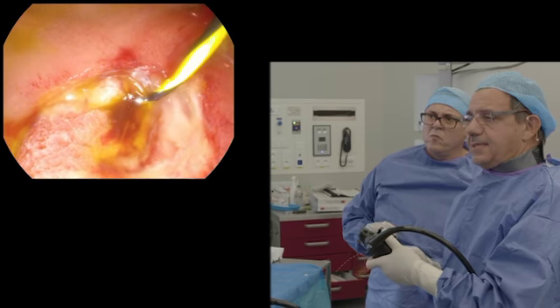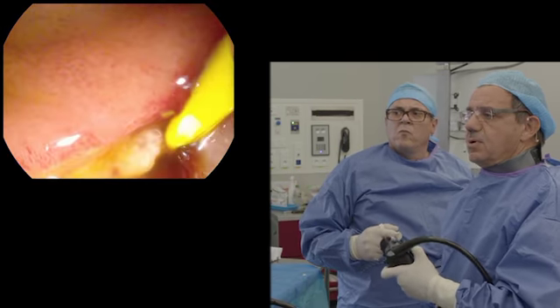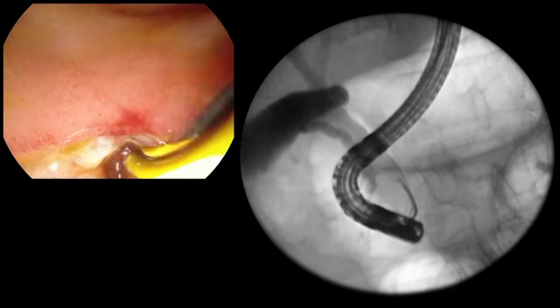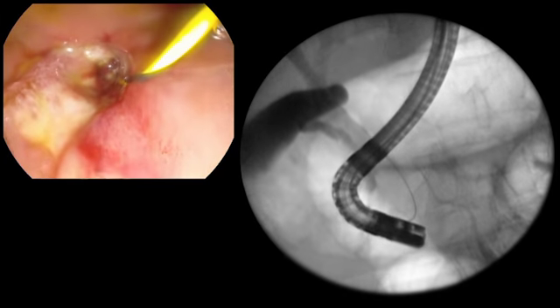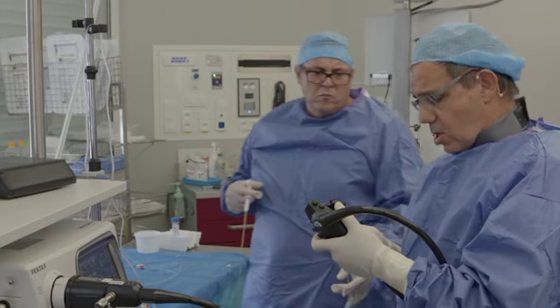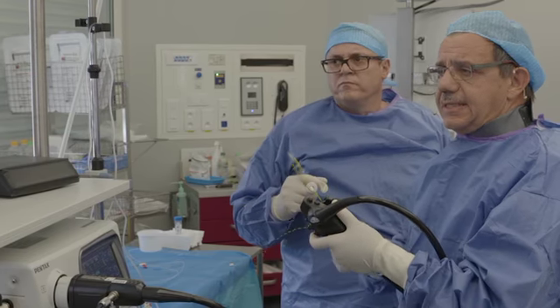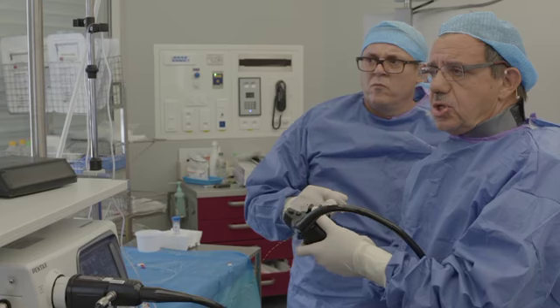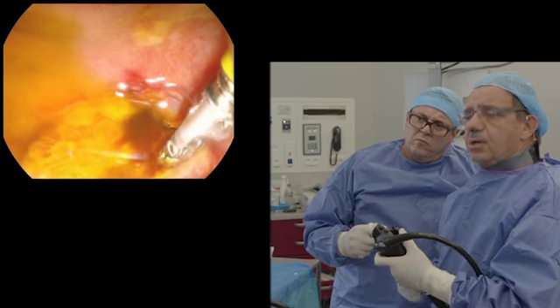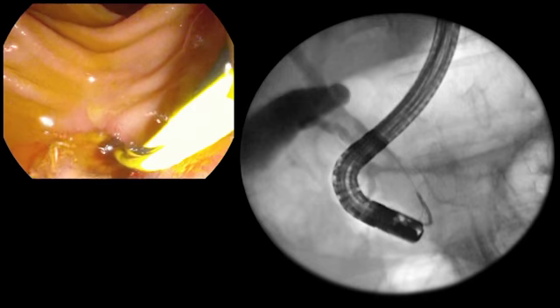Okay. And the last part of the procedure will be to insert a metallic stent because the patient has a high level of bilirubin, more than 100. X-ray, please. Open. Close. Perfect. And one more. And we plan to put a 6 or a 4 centimeter uncovered stent because a small metallic stent is not a contraindication for surgery. The only problem with the stent is the long stent, the 8 centimeter, because the tip of the stent will arrive at the level of the bifurcation, and the surgeon can have some problem to perform the anastomosis, but using a 4 centimeter stent is fine.